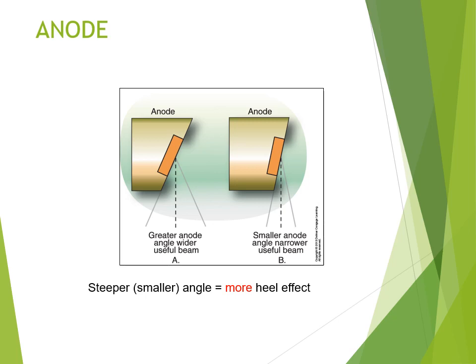And then finally, the smaller the angle, the more heel effect that we see. So that's the one thing that we have: a more narrow beam is going to result in more of a heel effect.